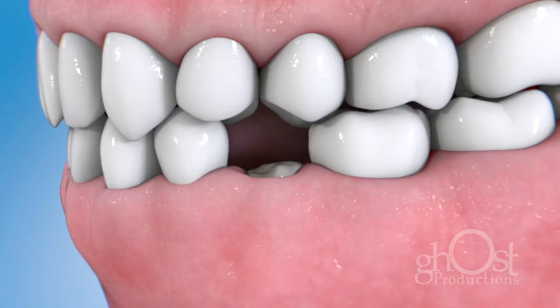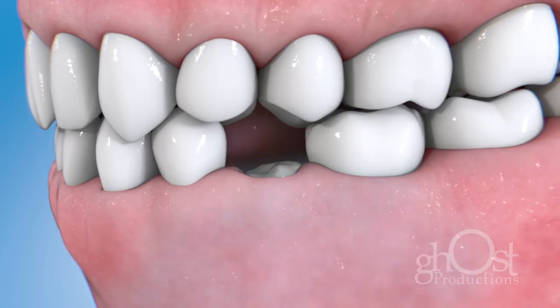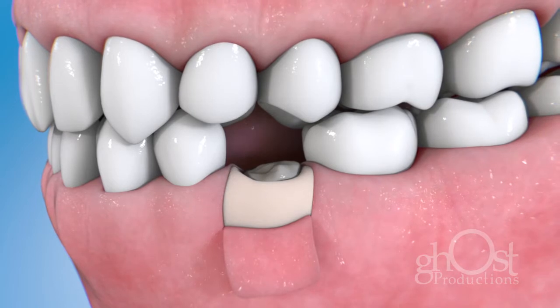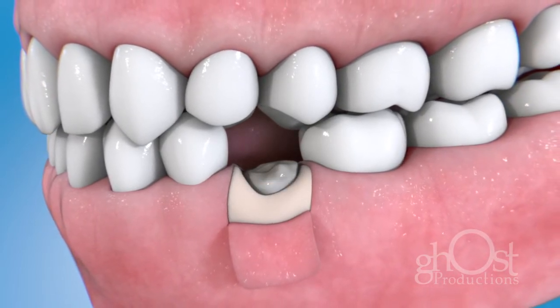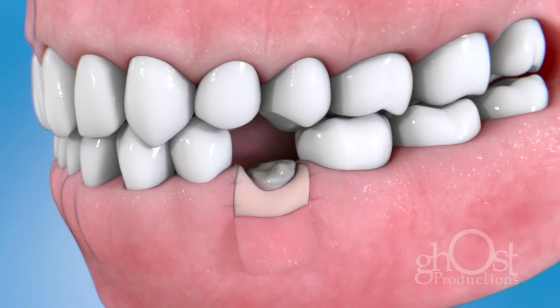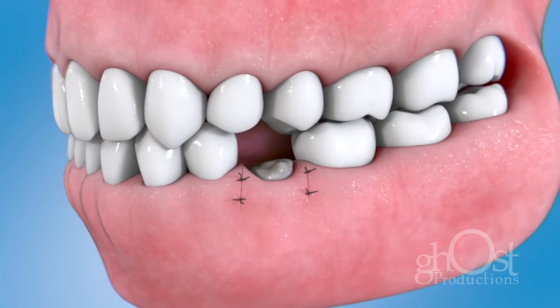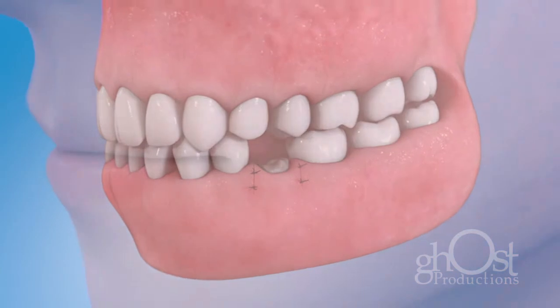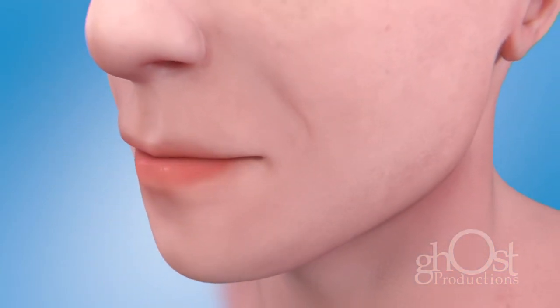The procedure. The periodontist begins the procedure once you are completely numb. A small incision is made and the gums are gently lifted away from the tooth. The bone and gum tissue are reshaped to reveal enough of the natural tooth to create a secure anchor for the crown and to maintain a healthy distance between the bone and gum line. A couple of sutures may be placed in the gums to speed healing.